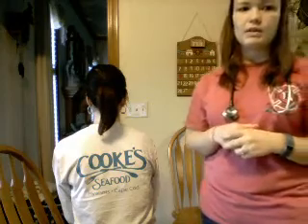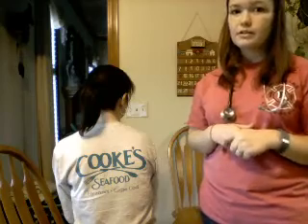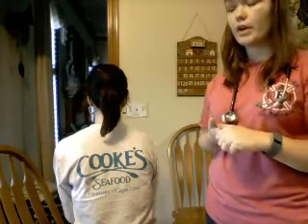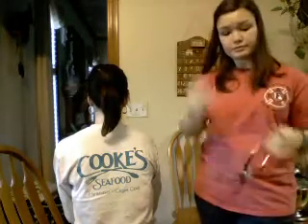And now I'm going to be doing the whispered pectoriloquy and bronchophony test. With this, I'm going to be having my patient say the phrase 1, 2, 3 as I listen in various areas of her back. And with this, I'm hoping to be able to hear that she's saying something, but it'd be kind of mumbly. I don't want to be able to hear exactly what she's saying. If I can have a clear reading with what she's saying through my stethoscope where it sounds like she's whispering in my ear, that is an abnormal finding that I would want to report.